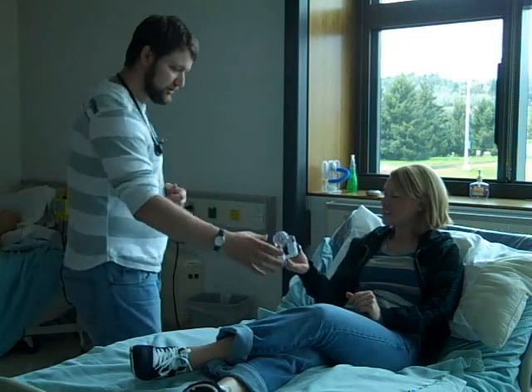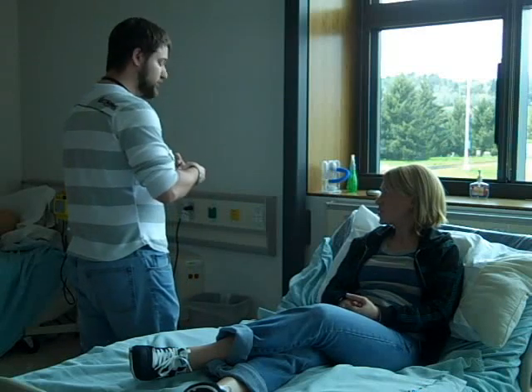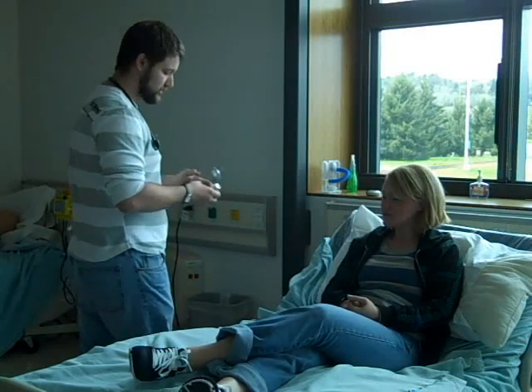Was that okay? That looked good — that looked awesome. Patient asks: You want me to do two puffs? When you're at home, yes, two puffs. With this instruction session, we're just going to go ahead and do it once.